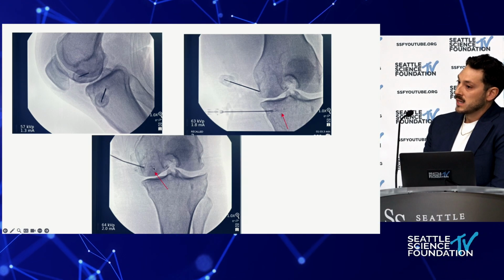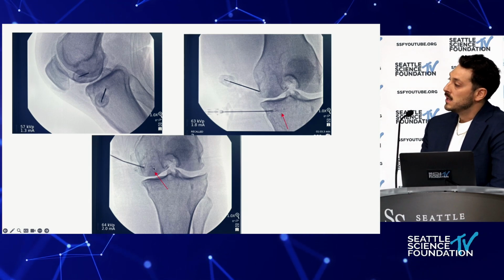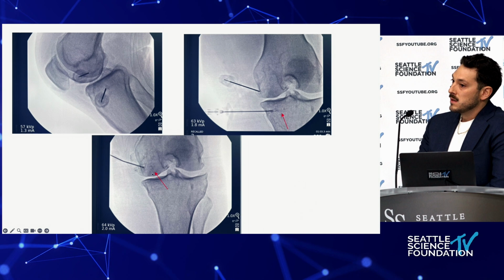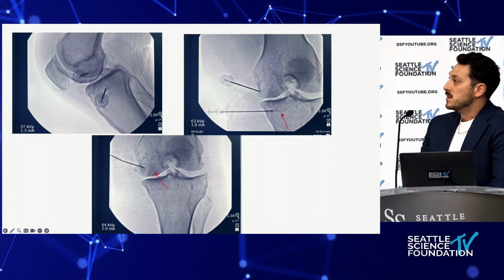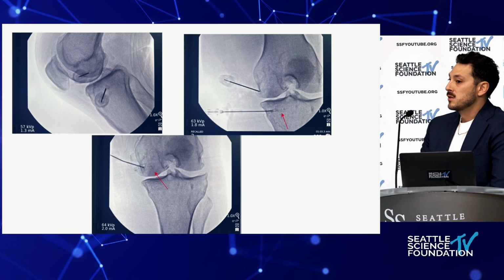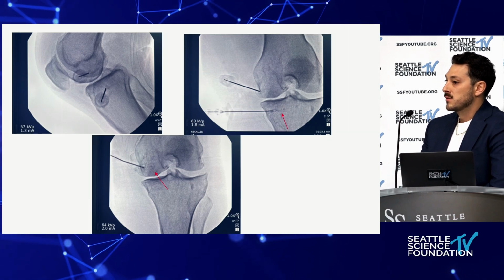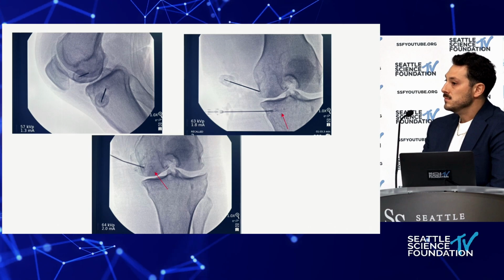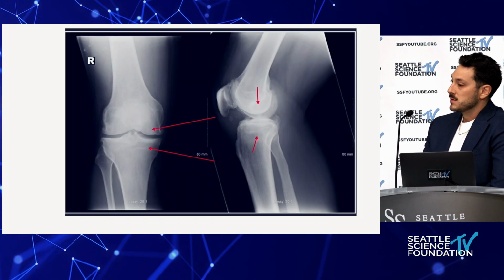You make sure your contrast is staying in the bone, and then you slowly inject, typically over a period of about 10 minutes. For this, you're going to be getting the volume on that, Gavin. The volume is 10 cc's is what you're going to get from 120 with the system that we use. So 5 cc's goes into the superior and 5 cc's goes into the inferior. And then, of course, here would be your trajectories.